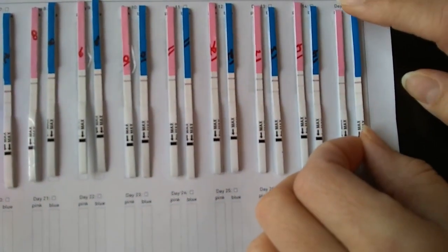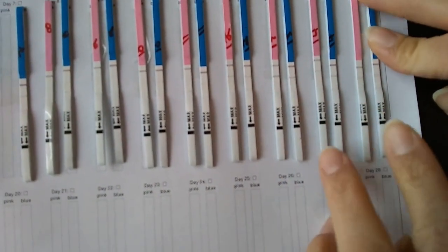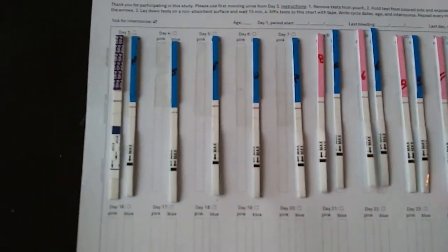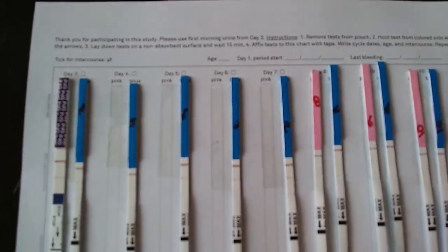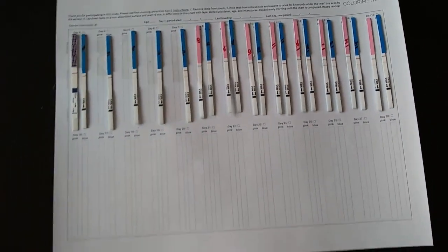and the blue strip. Now the only reason we're collecting strips is in case some of the images aren't processed accordingly, we can go back and we can re-image them at a later date. And that's it. Thanks so much for participating in the study, and if you have any questions, let us know.